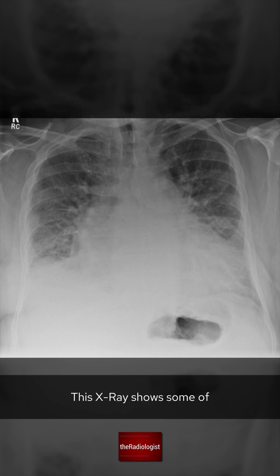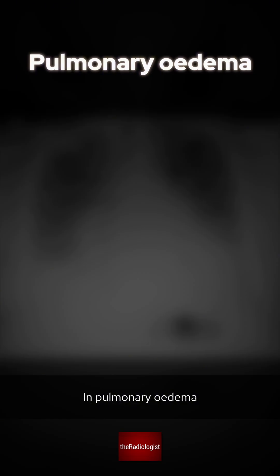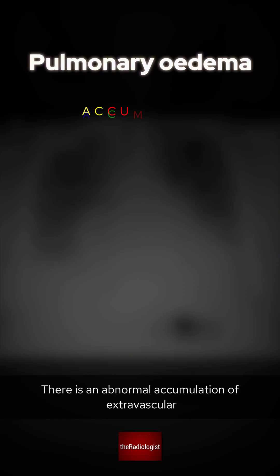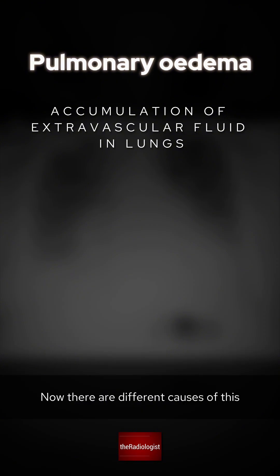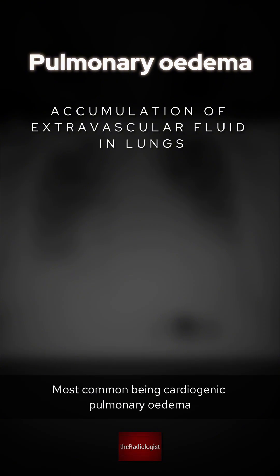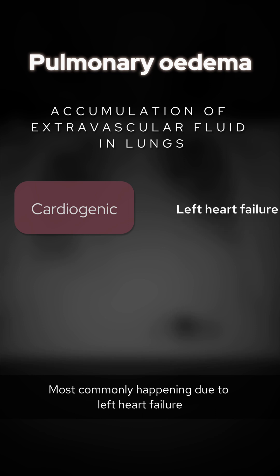This x-ray shows some of the classic features of pulmonary edema. In pulmonary edema, there is an abnormal accumulation of extravascular fluid within the lungs. There are different causes of this, the most common being cardiogenic pulmonary edema, most commonly happening due to left heart failure.